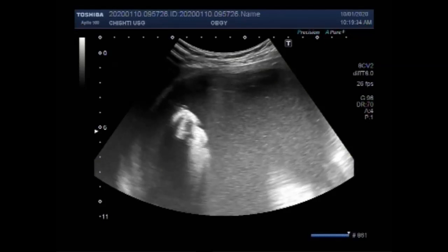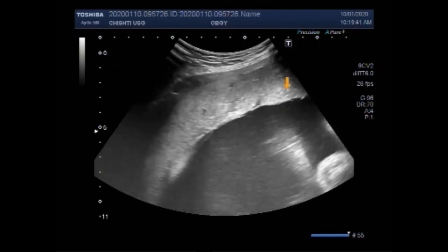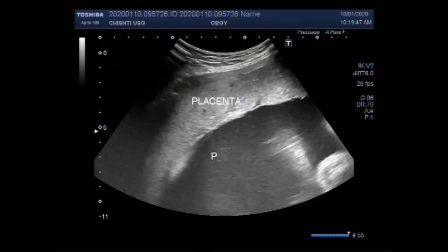Meconium passage into the liquor amnii is noted. The placenta is seen, lying anteriorly and left lateral. Polyhydramnios is also seen.